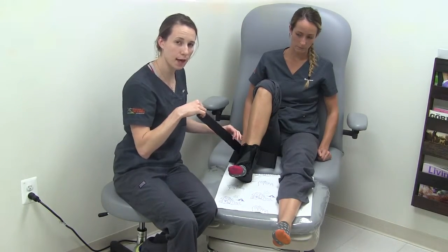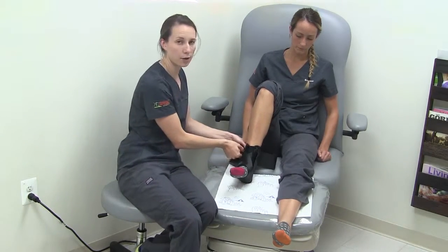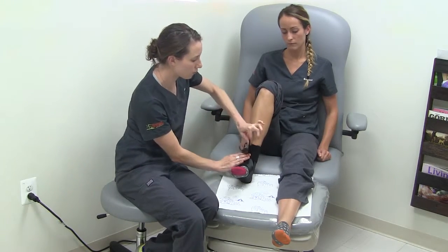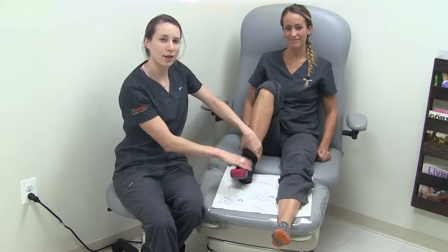With the second strap, you'll do the same thing — cross up over the foot, under the arch, and secure back onto the same side. These two straps come together, overlap, and secure again. Now you can put your shoe on and go about your day.